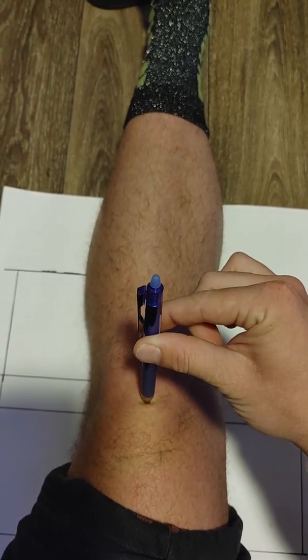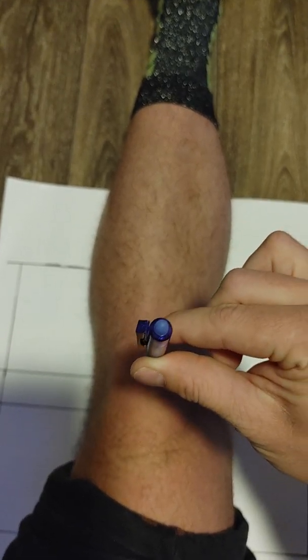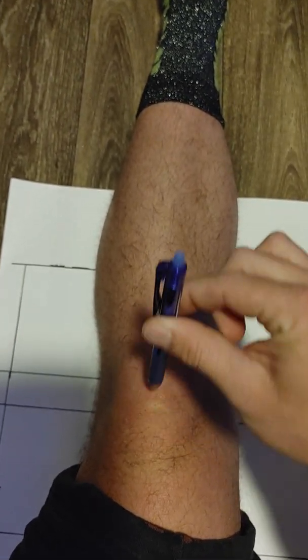This view could also be done standing, and if it's done standing, the image receptor would be perpendicular and not at an angle.